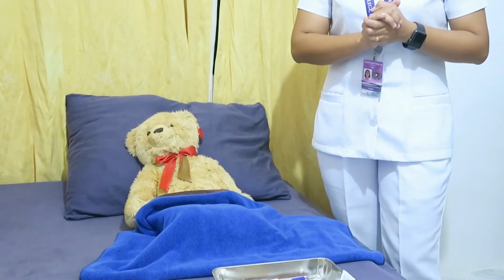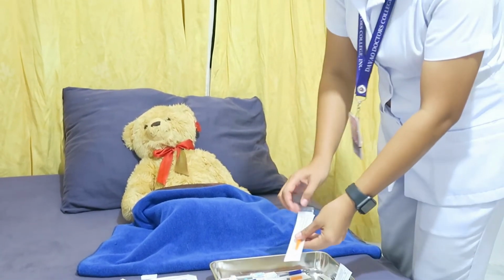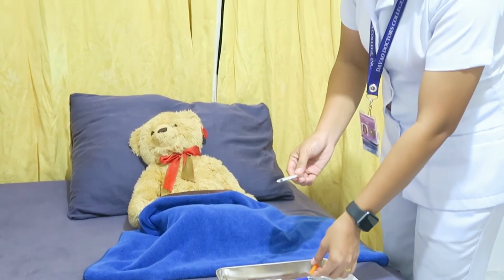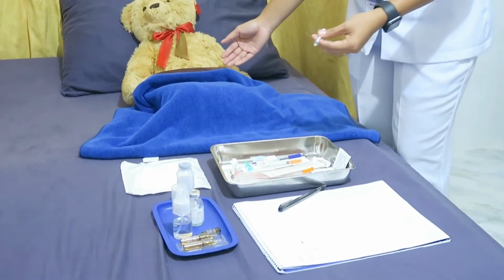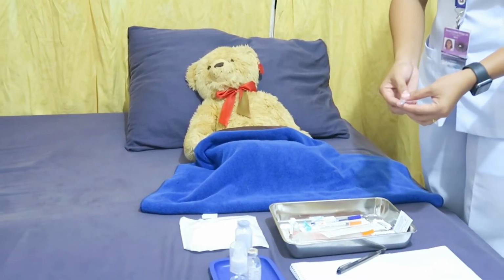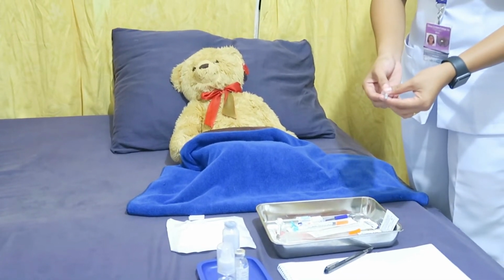And after that, prepare the syringe for injection. So this is our syringe. Then, remove the needle cup. So, remove it. While waiting for the antiseptic to dry, pull the cap straight off to avoid contaminating the needle by the outside edge of the cap. The rationale for that is to avoid needle prick injuries.